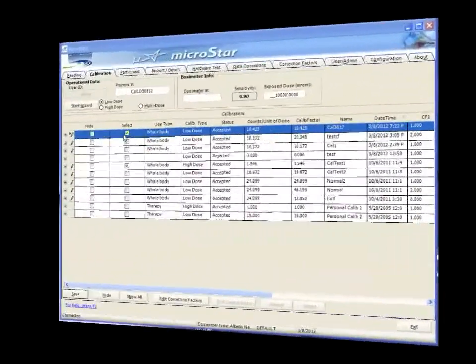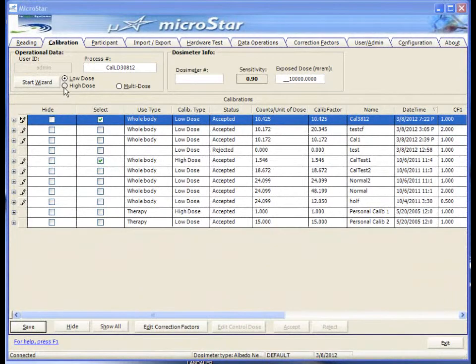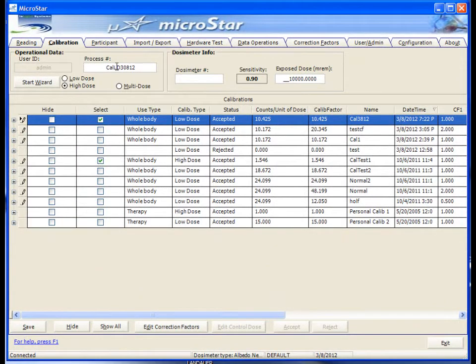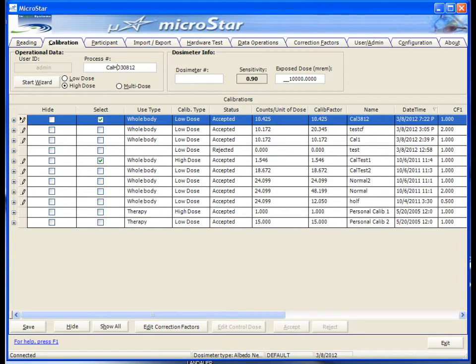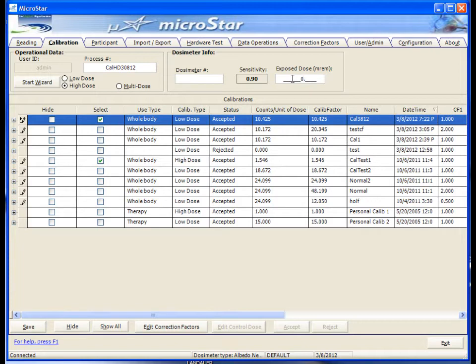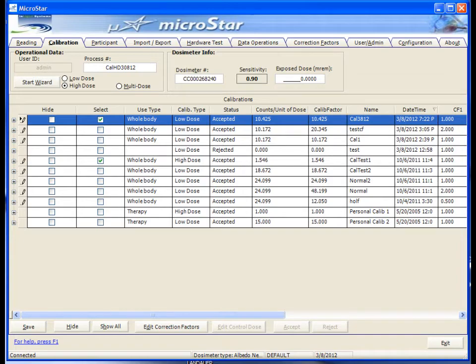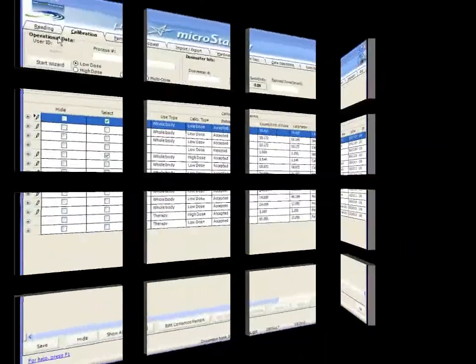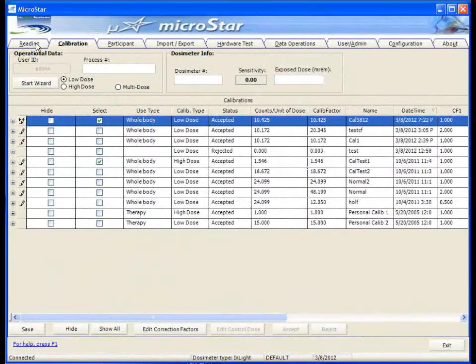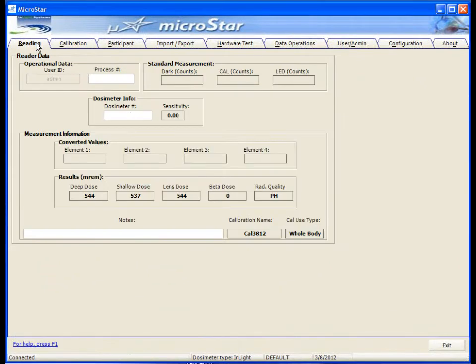You can now proceed to do the other dose calibration by following the same procedures. Once you have completed your calibrations, do a check by going to the reading screen and reading QC badges to validate.